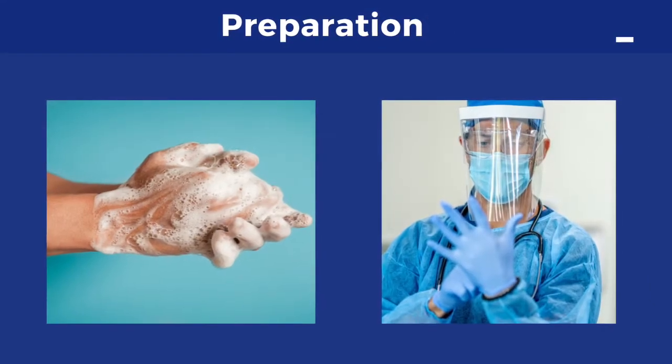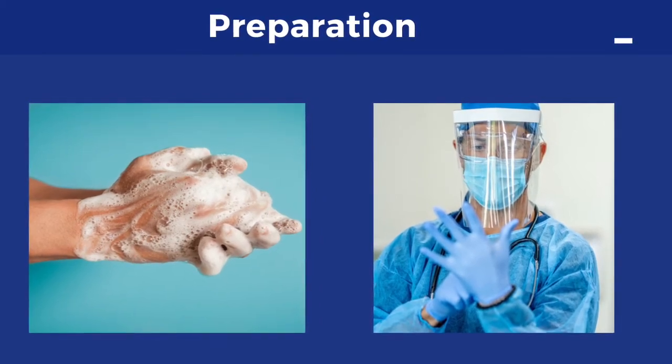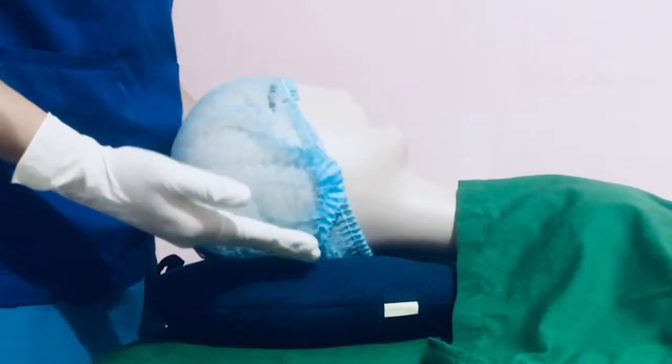Prior to intubation, do hand hygiene and wear appropriate personal protective equipment. Assess the patient for possible difficult intubation. In doing this, use the mnemonic LEMON. Look externally for any facial or neck deformities.